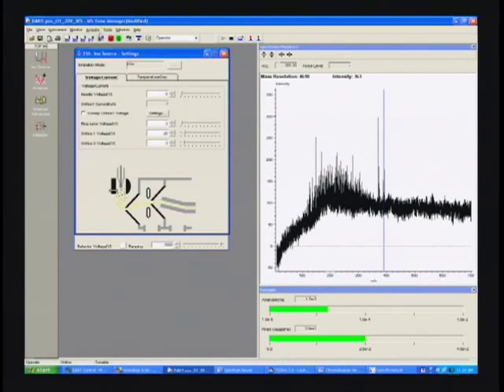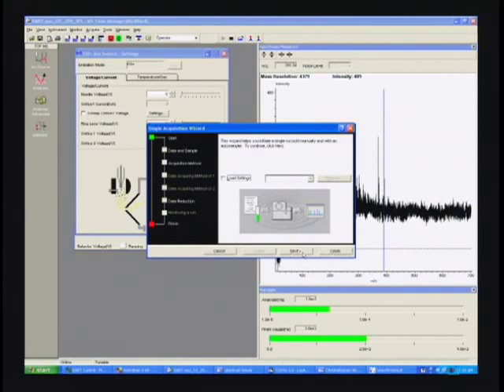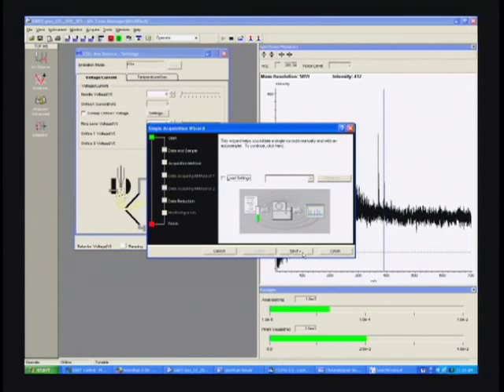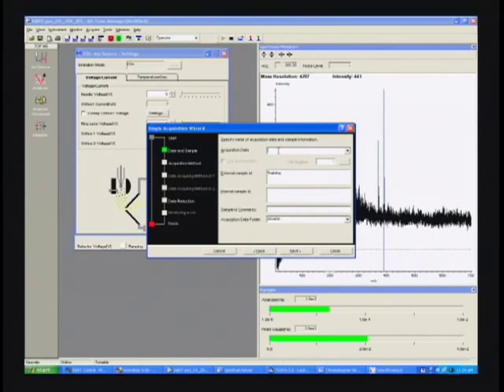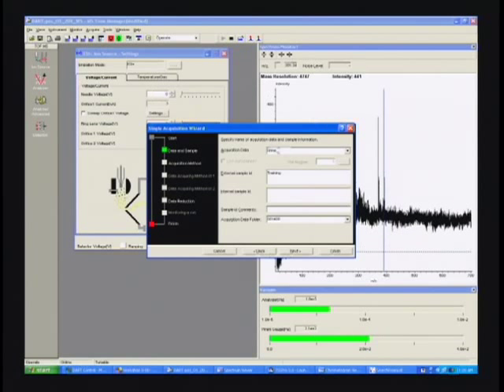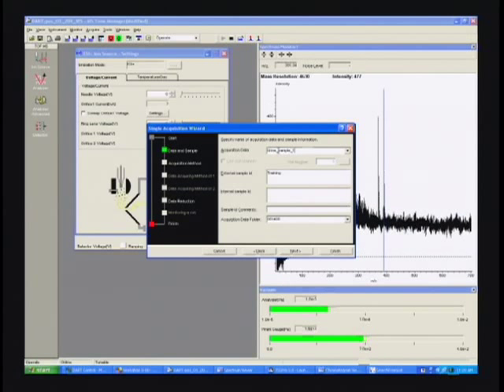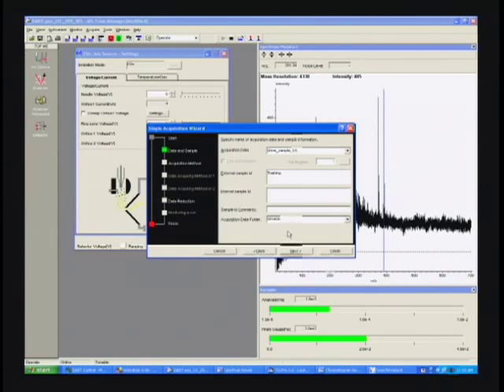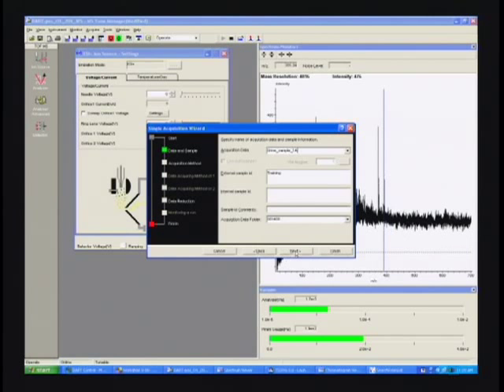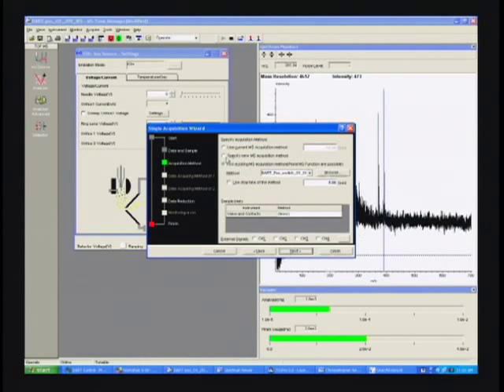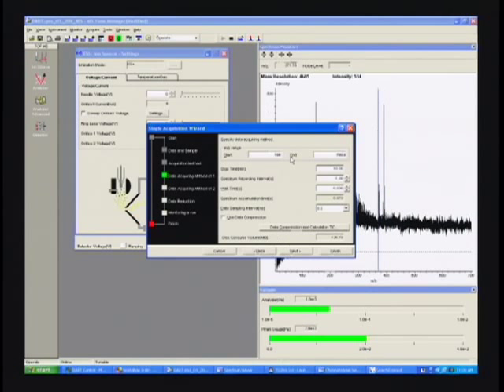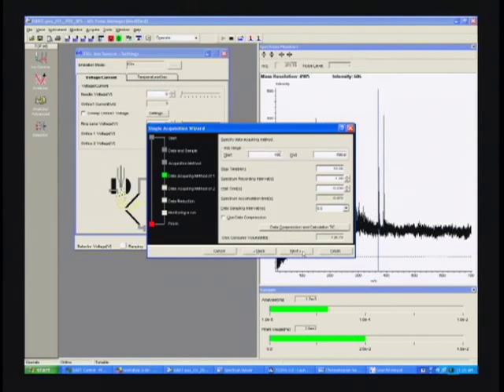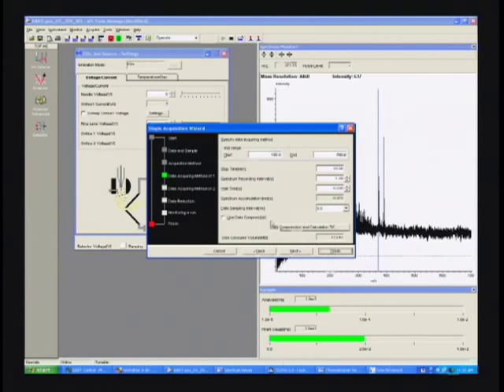Now we'll go ahead and set up acquisition. Let's call it urine sample 1A. Normally I'd put some notes in the comments fields, but let's just leave that blank for the moment. We'll run acquisition from 100 up to 700. One second acquisition, and that should do it.